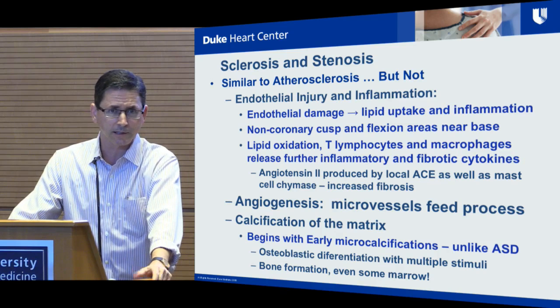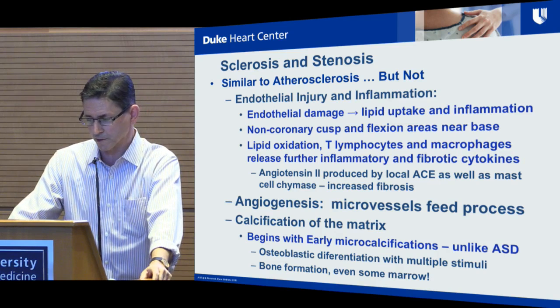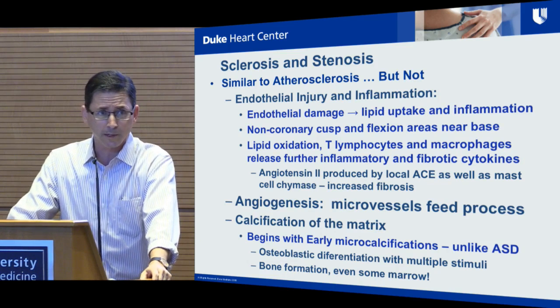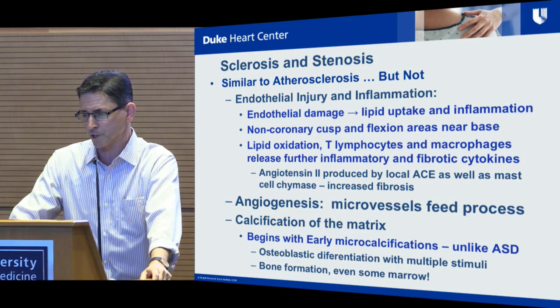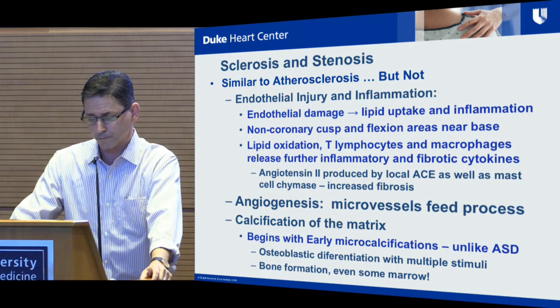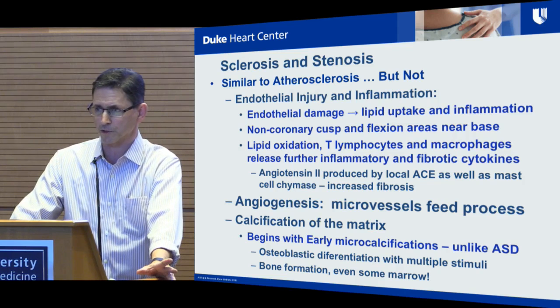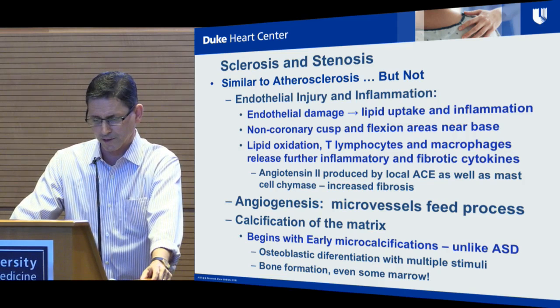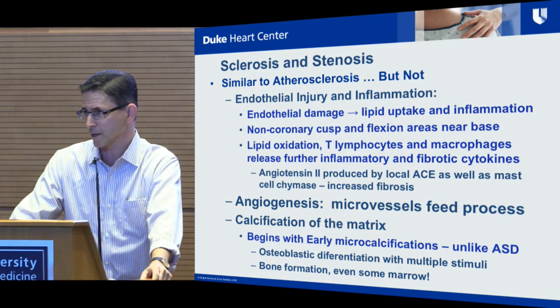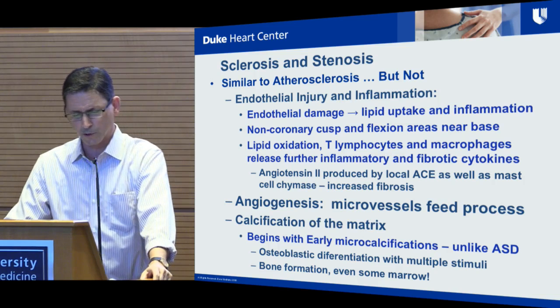And then calcification is key, and I'll show you some images of calcification, and we'll have some in the wet lab so you can see just really how prominent the calcification is, and appreciate how it's something that does have to be accounted for and dealt with when you're deploying a device across the aortic valve. And then I'll show you a little later how it differs in the mitral and has its own essentially set of concerns. But I'll also show you how the mitral valve, when it calcifies, can mess with your ability to get a nice placement on an aortic device.